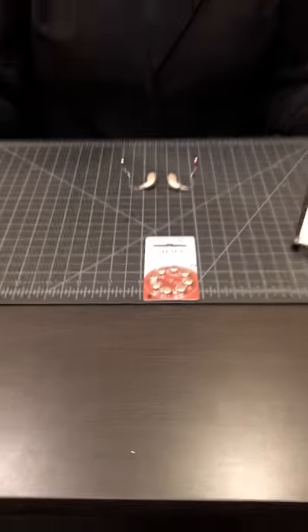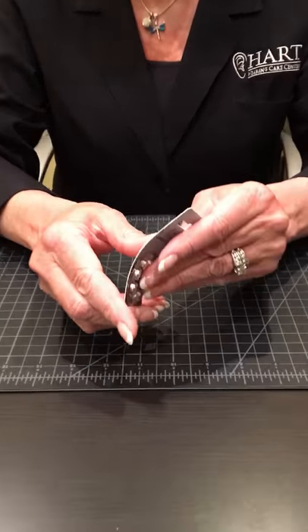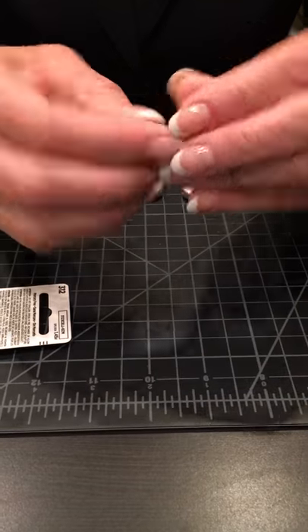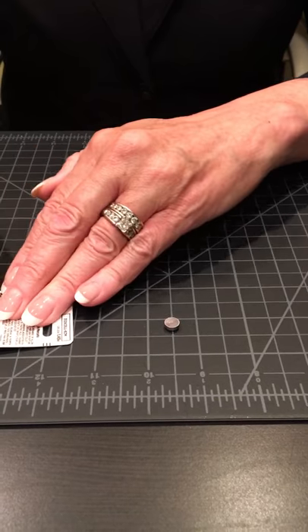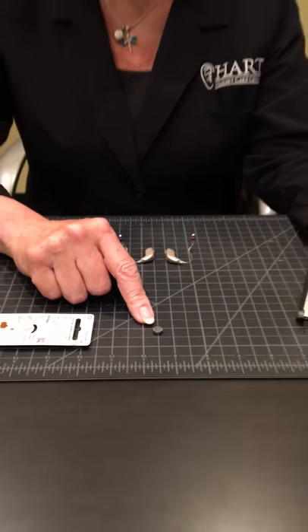Good afternoon everyone. Just a friendly reminder: when changing your batteries, in order to get the longest battery life, we want to make sure and take the tab off of the battery and let it sit untabbed for two minutes, because the battery is activated by air.